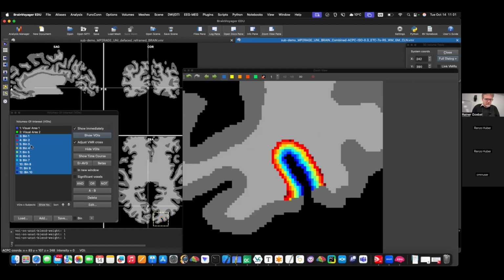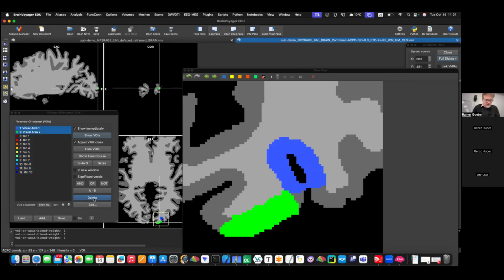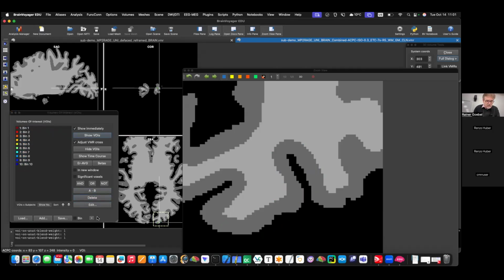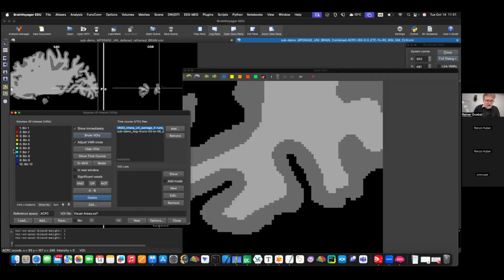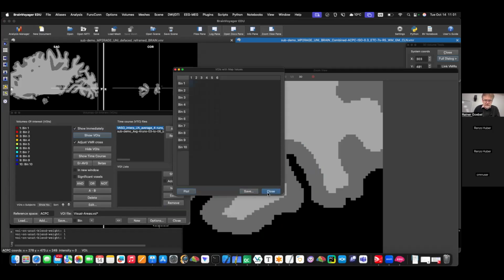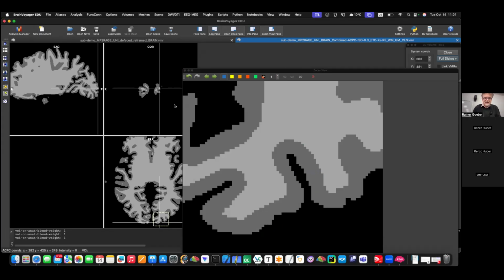We can just say, actually, for the moment, I remove these two guys because they would otherwise also be sampled. Actually, it's not bad. You get the mean of these areas, how much effect is in the whole areas, but I just remove it now and just say, show me a table with pooled for each of these voids. What is the effect? First, one thing I forgot. Actually, this is interesting too. You can sample the thickness map or the distance map, but not as exciting.